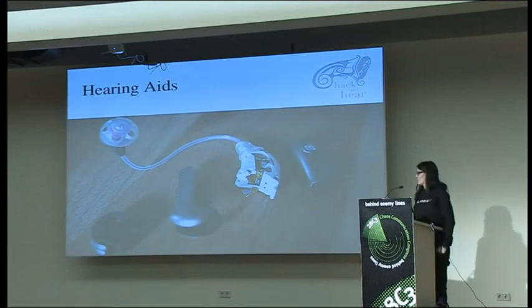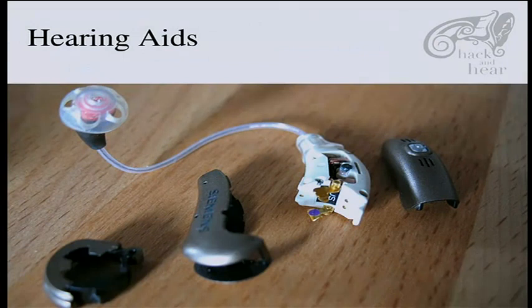You can see they have shells which you can take off, like for mobile phones, so you can switch the color and choose a different one. And the body still, I know this picture is not really good, there's still a lot of plastic around it. And the white part has two microphones, the signal processor, and antenna that's used for peripheral hardware, I will come to that. And the speaker is actually at the part that goes into the ear.